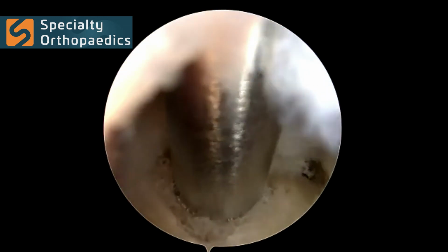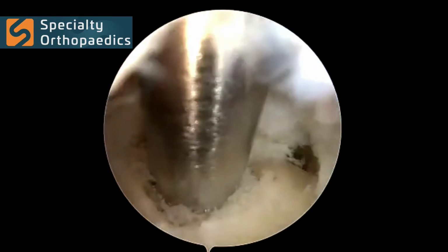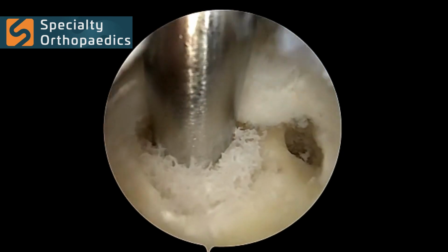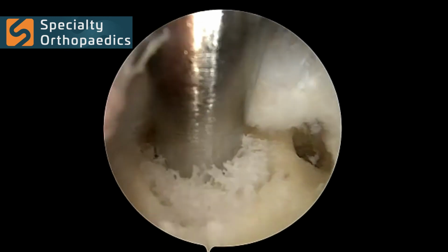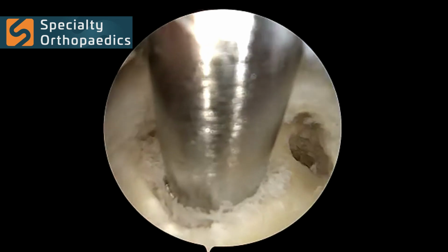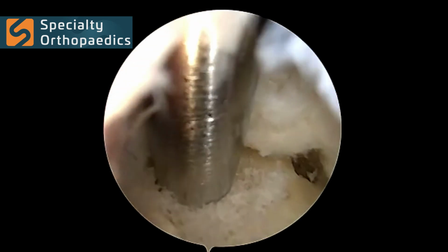Once the graft is fully impacted and stable within the lesion, we will then insert an arthroscopic shaver and remove any loose debris from within the joint. When complete, this provides restoration of the bony surface area to allow for anatomic rotator cuff repair.